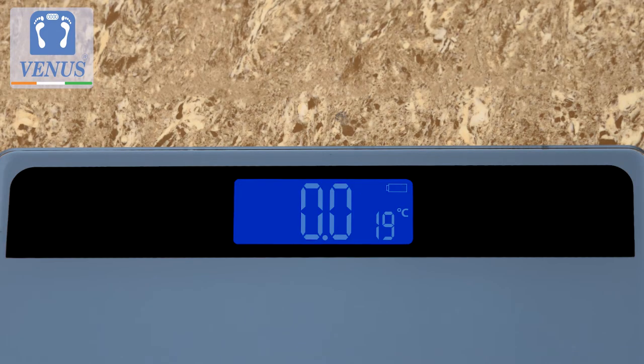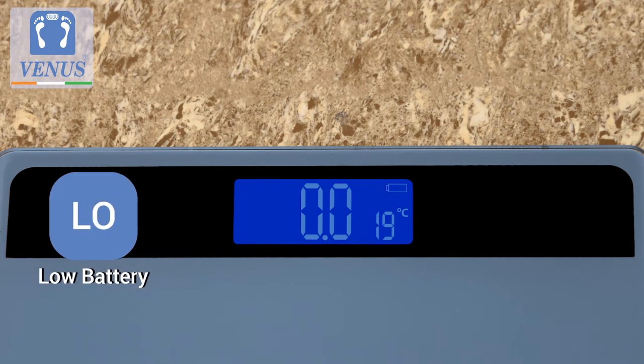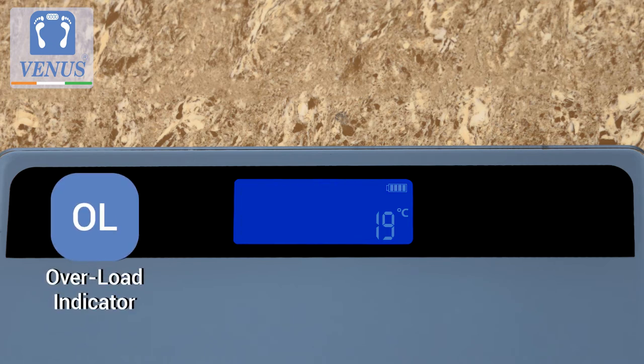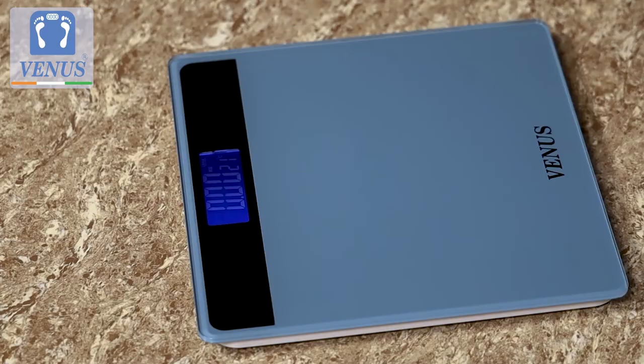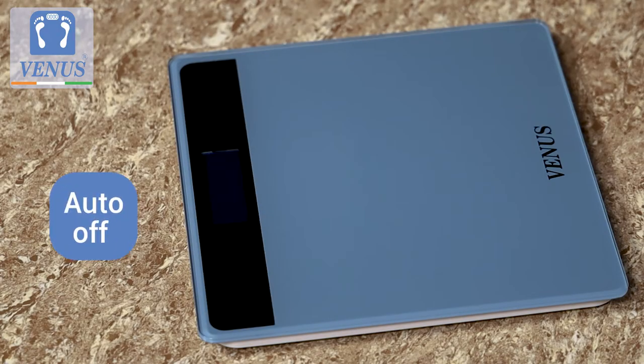The display is easy to understand. LO indicates low battery, OL for overloaded, or ERR for an error in the reading, and it comes with an auto-off feature.